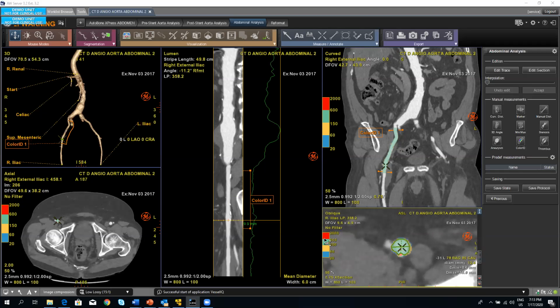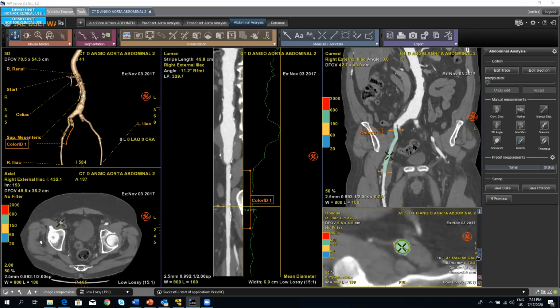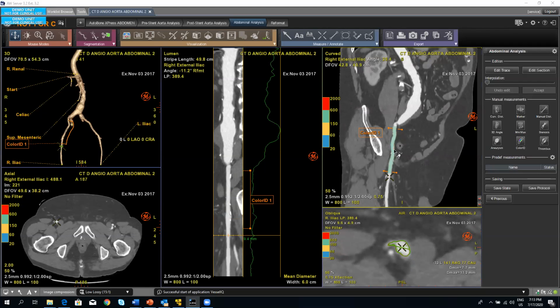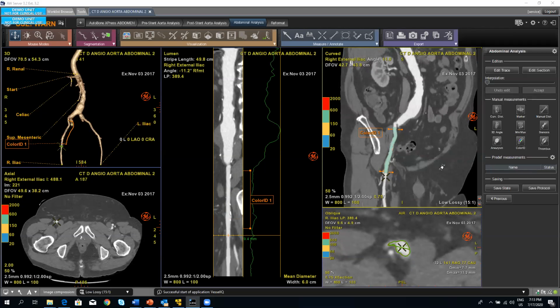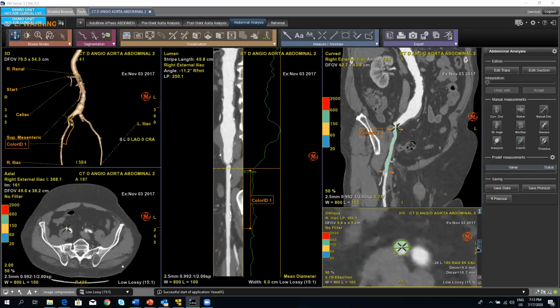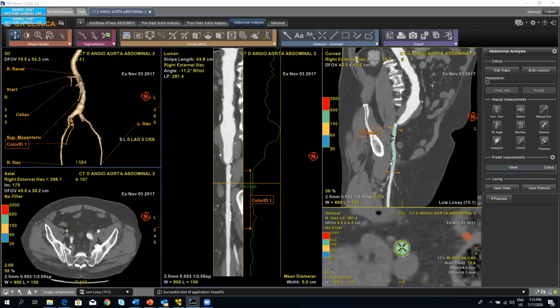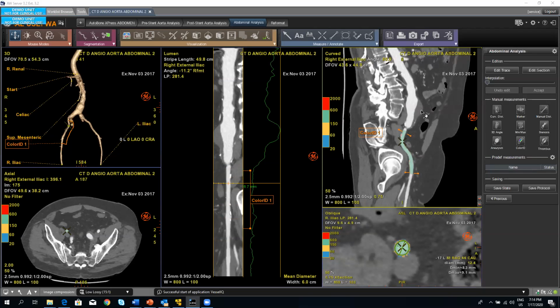So it gives you a color code with specific thresholds and color codes the vessel that you segmented. So you're gonna have the information about this vessel. Look here, for example, we have a calcified plaque. So you see this is green, okay? Oh, sorry, this is red, okay? So very simple to use as well. Just select the vessel you want to segment and the system will give you a color map of this segmented vessel, okay? And here in Vessel IQ, we can also extract, in this case we have a thrombus.